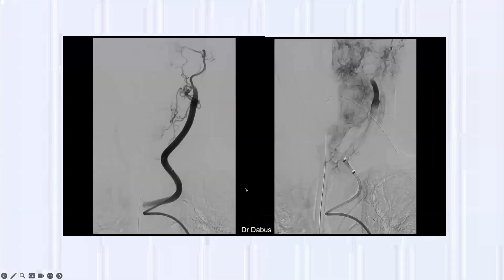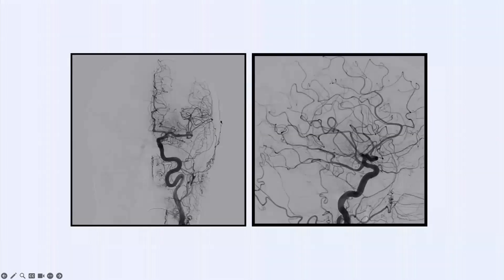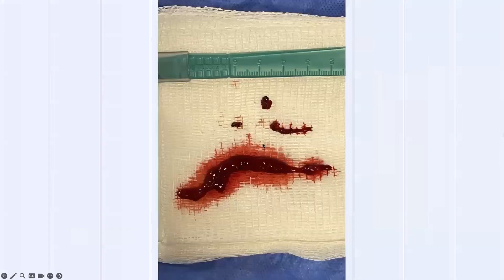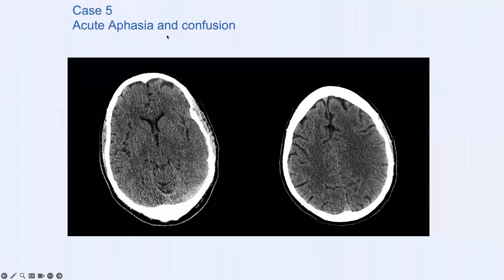At angiography, the left ICA occlusion is opened, all clot is removed, and an excellent result is achieved — the ICA open, the near-fetal left PCA open, and the anterior choroidal artery open. This patient had an NIH Stroke Scale of zero at 24 hours and a totally normal brain CT.